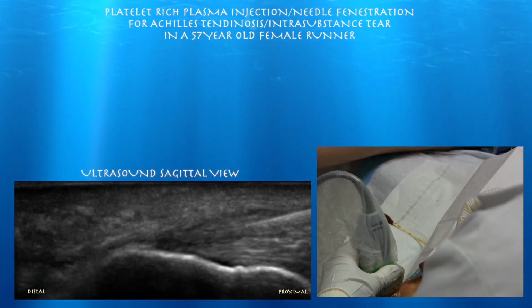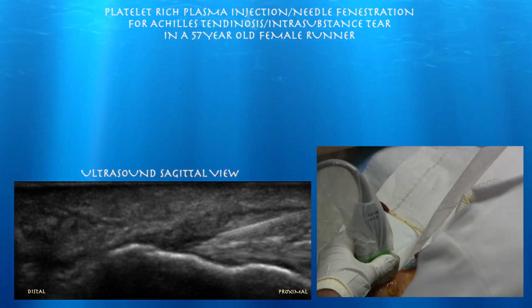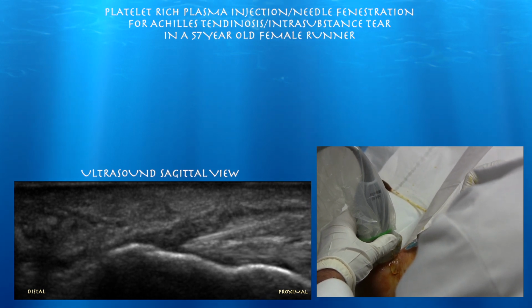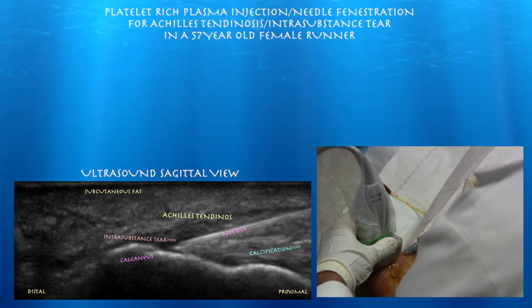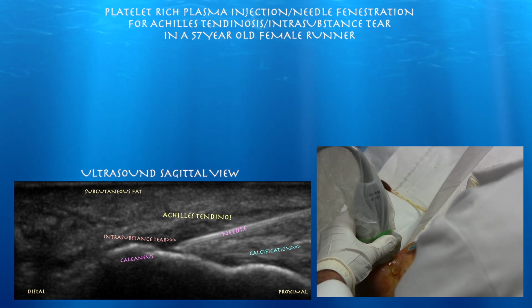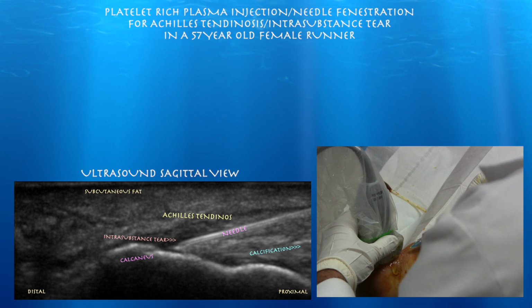So that's our tenotomy. We're at long axis view or sagittal view. And here we are, we're basically trying to get right near to the calcaneus. Going right to our calcaneus, essentially. You're doing very well. You okay? Alright, now you're going to feel some pressure. We're going to inject with some PRP now.